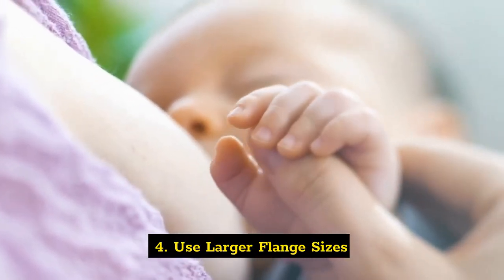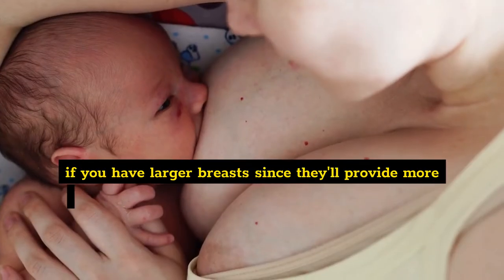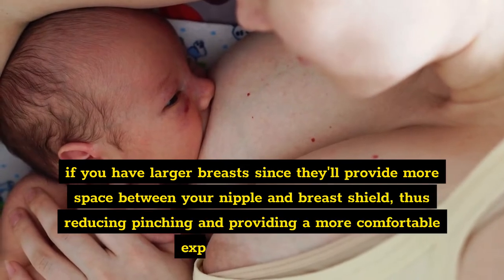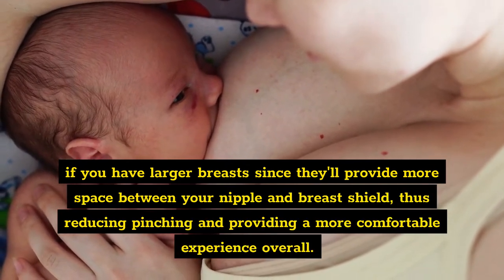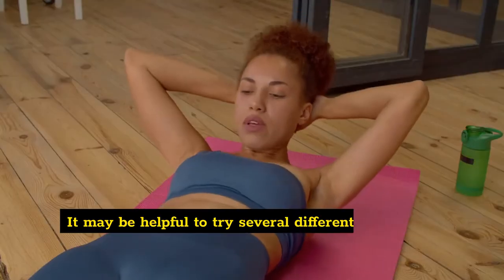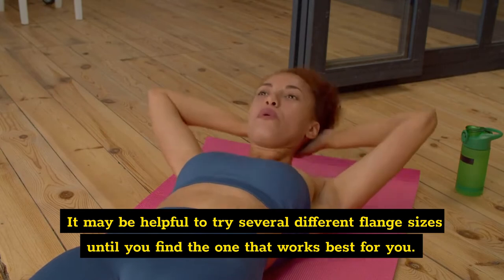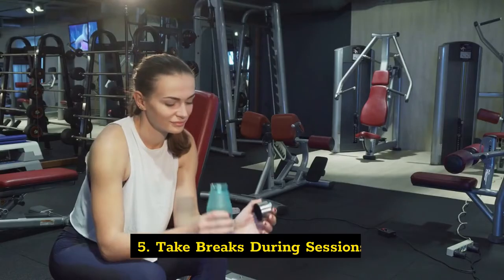Four: use larger flange sizes. It's important to use larger flange sizes when pumping if you have larger breasts, since they'll provide more space between your nipple and breast shield, thus reducing pinching and providing a more comfortable experience overall. It may be helpful to try several different flange sizes until you find the one that works best for you.